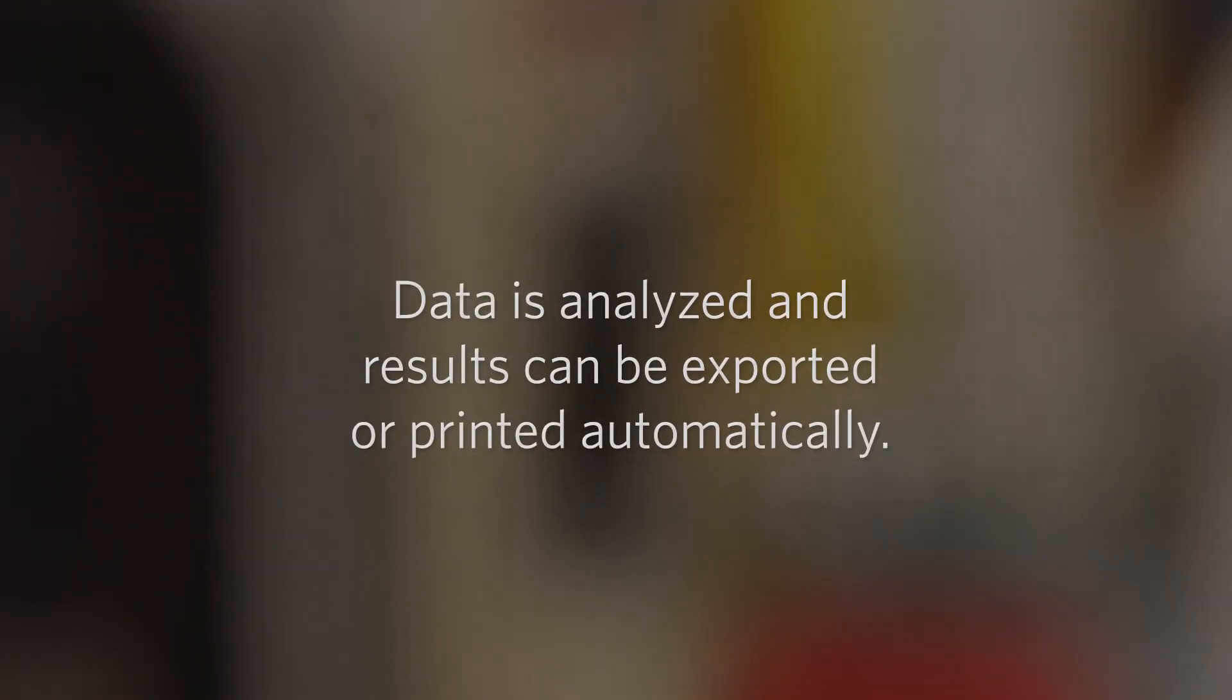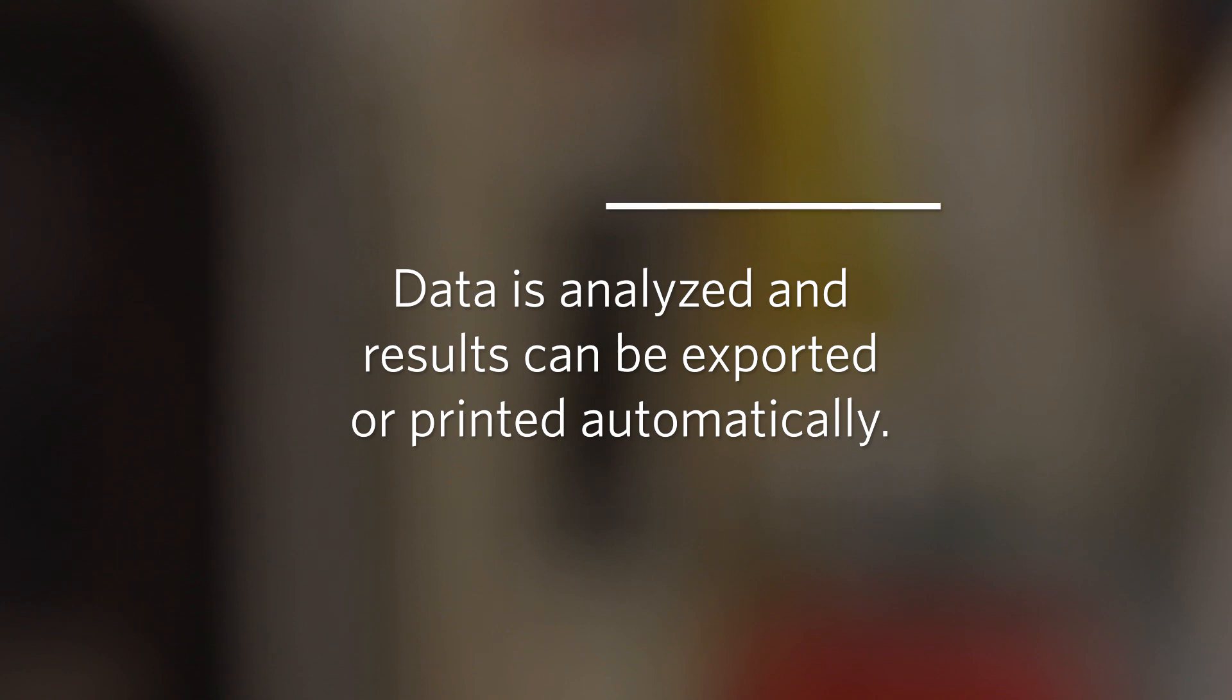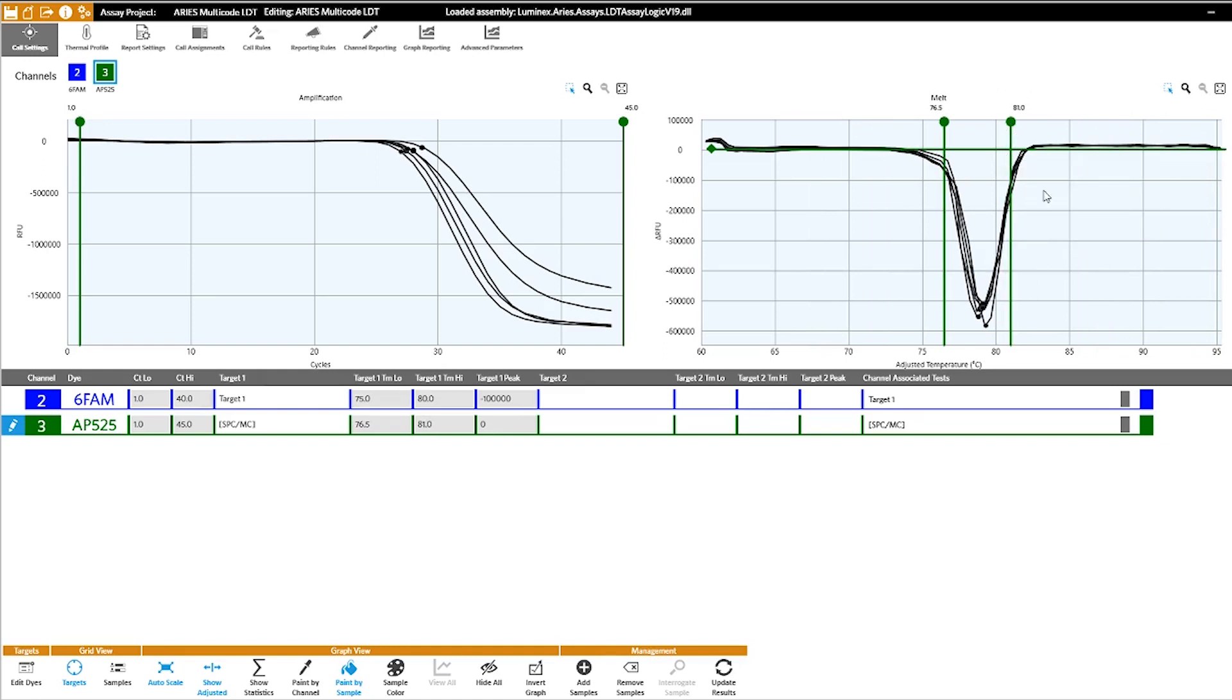Upon completion of the run, the data will be analyzed and the results can be exported or printed automatically. Synced software also allows for further analysis of the raw data, which enables you to make additional adjustments to the assay file parameters.